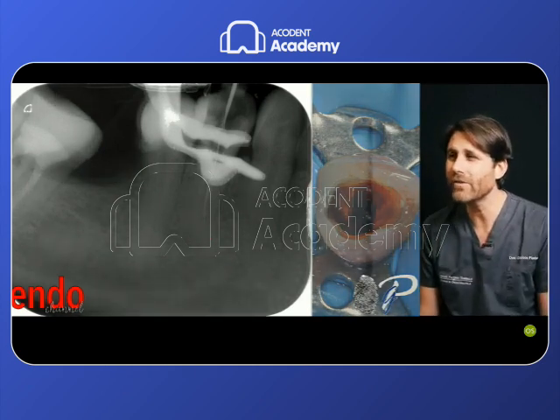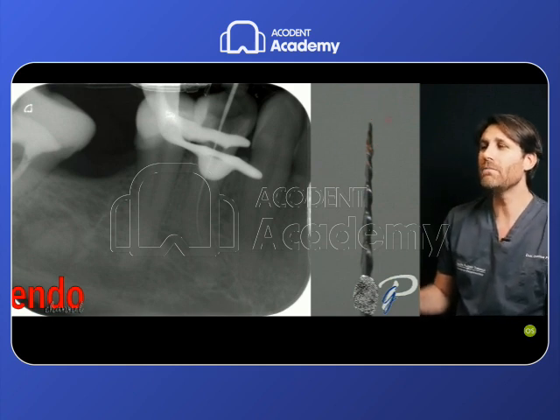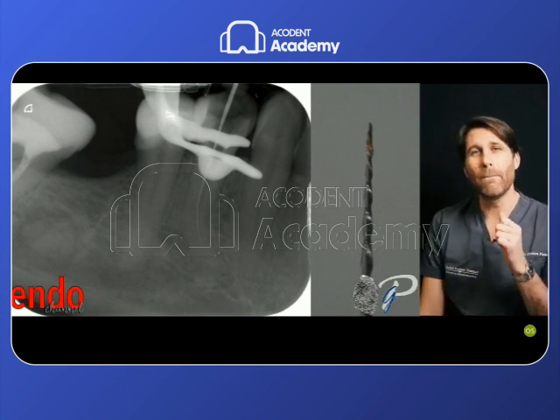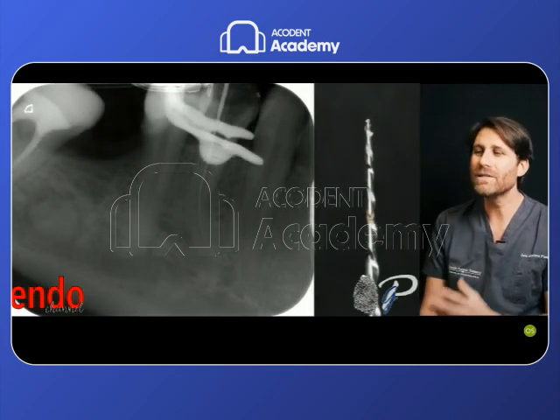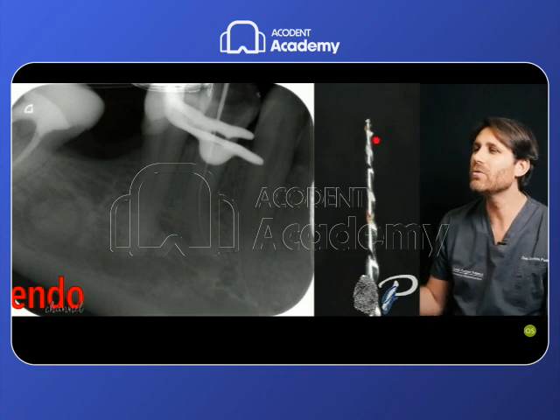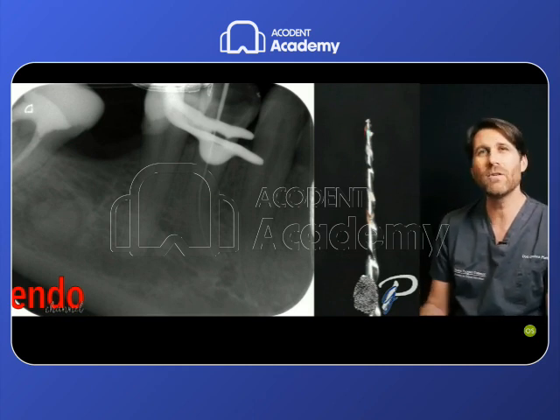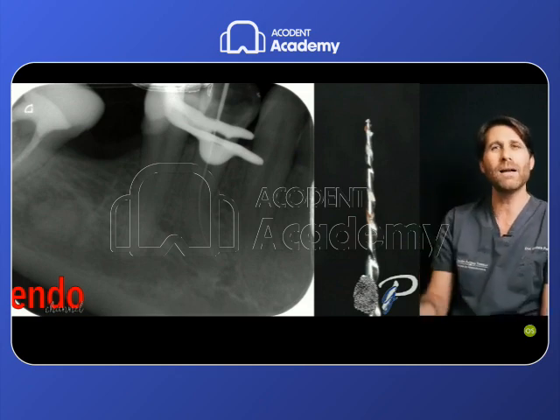So in this case, we can work with this technique by working with the tip of this reciprocating file with a 1 second pushing action and go away. And proceeding slowly, very slowly, perhaps we cut 0.2, 0.3 millimeters, maximum 0.5 millimeters each time that we do only one stroke apically and go back.